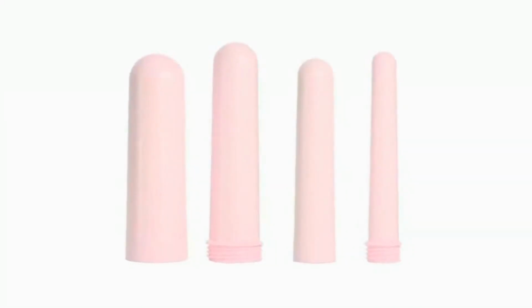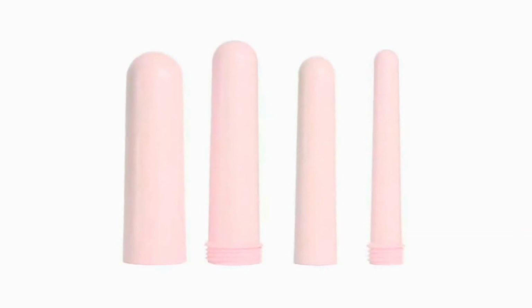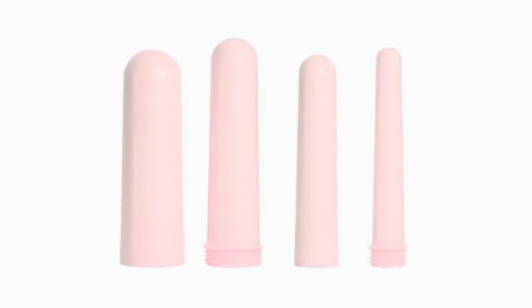As you can see, there are 4 sizes of dilators. We would advise you to start with the smallest dilator and then gradually progress through the sizes as you feel ready. Normally each dilator is inserted for 5 to 10 minutes at a time.